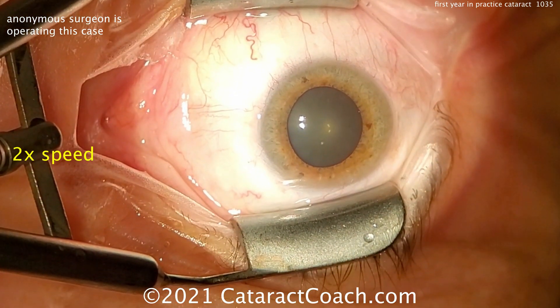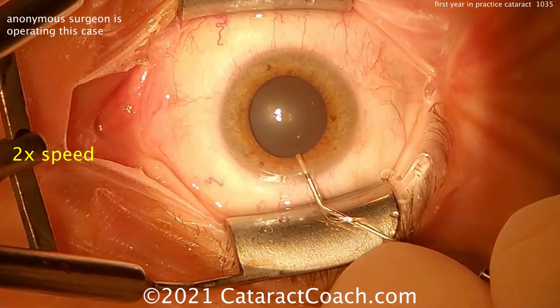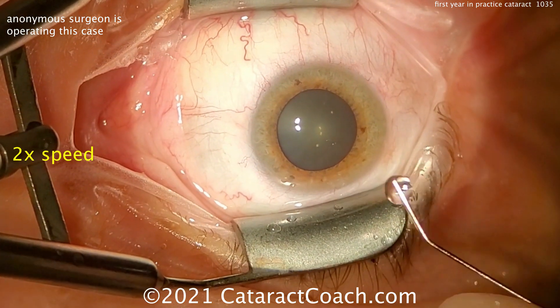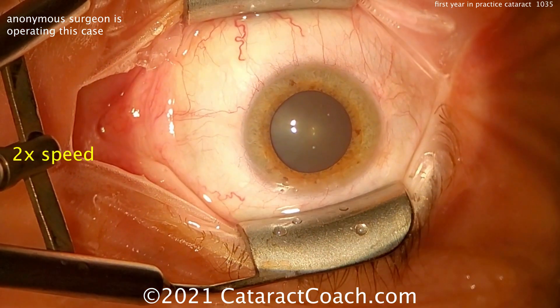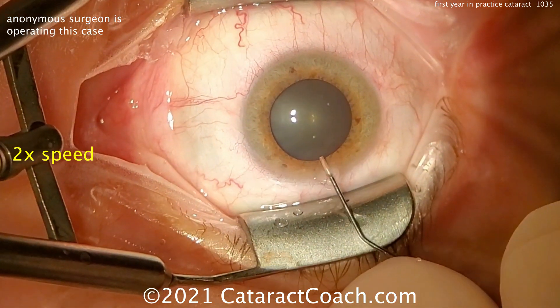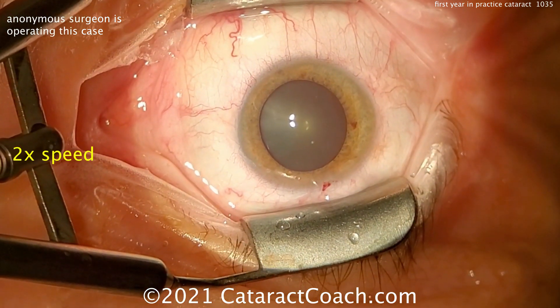There's the side port incision being made. We're showing the whole video at two times speed so we can get through the whole thing. Some anesthetic being put in the eye. There are little color fluctuations here due to the recording, so don't worry about that. Here comes the dispersive viscoelastic — that looks like a good fill. Normal pressure.